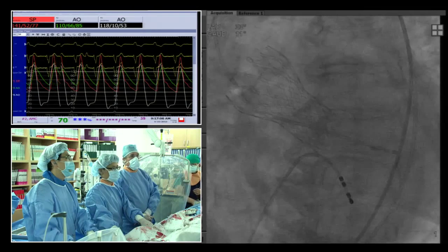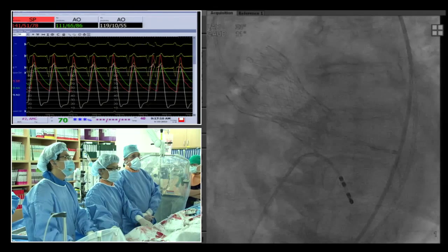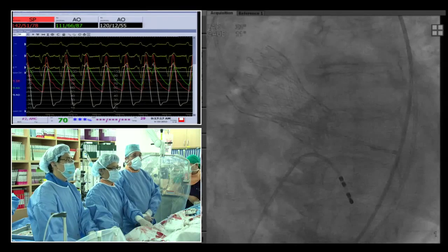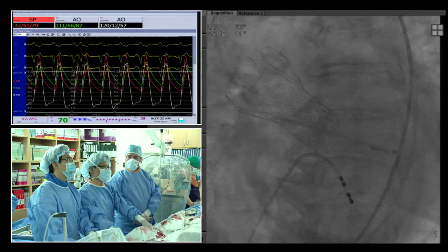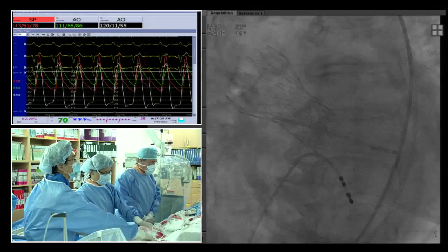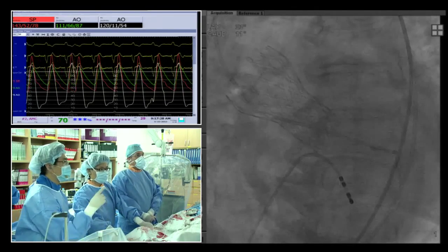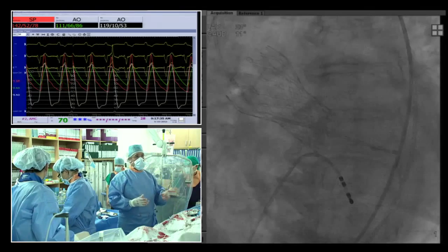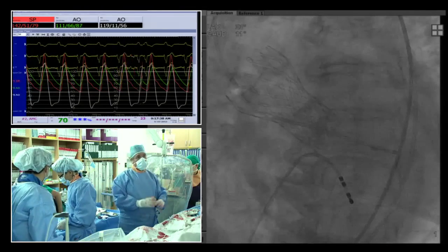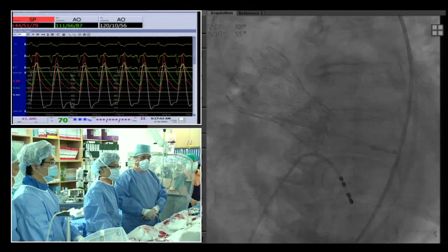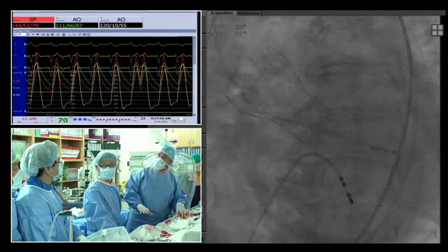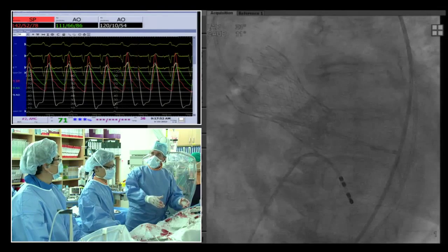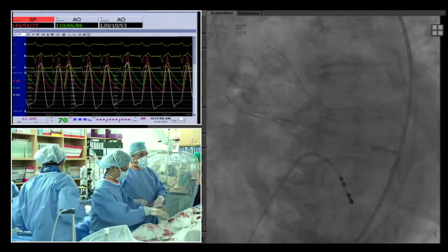The pressure tracings remain ambiguous — if taking the green tracing, it would suggest more pressure in the aorta than the ventricle, which would be paradoxical. The team decides to flush all lines, re-zero, and attempt to obtain cleaner hemodynamic data. Time is available, so they will try to align the hemodynamic values properly and make a clearer choice between the red and green tracings.